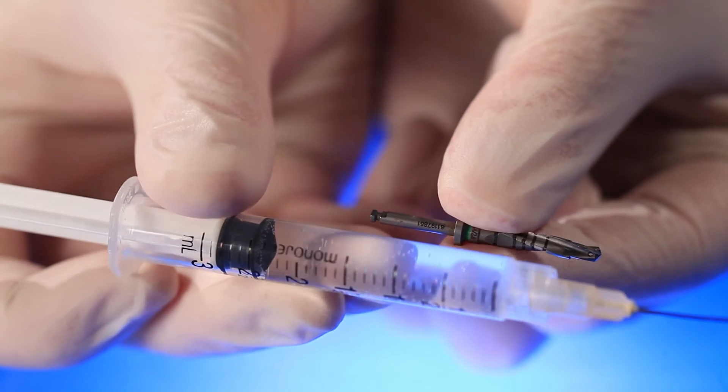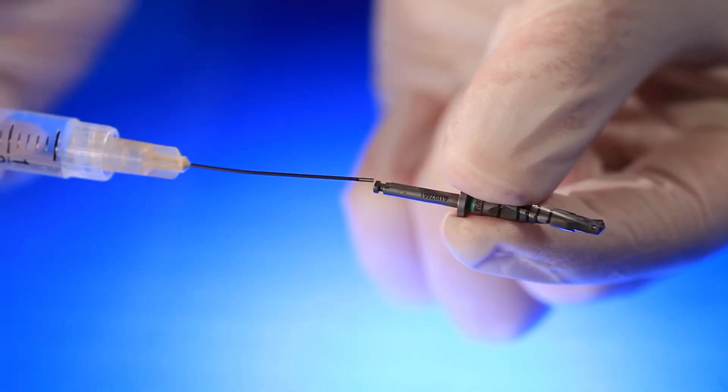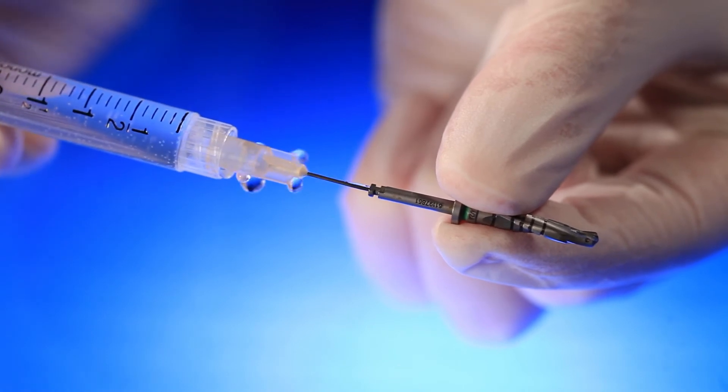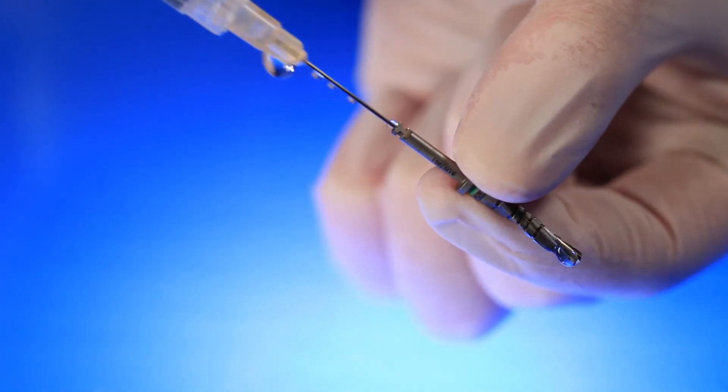If the drill is designed with internal irrigation, it is crucial to flush the internal irrigation canal with a small diameter syringe. If you don't, bone from previous cases gets stuck in the drill. Not only is that a problem, but your drill will not cool as quickly while drilling.